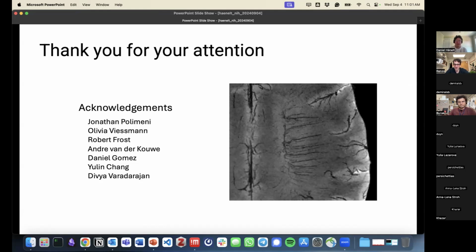Gotcha. And you're not worried about T1 steady state history effects, that you have a steady state with the Ernst angle, and then you have a break, and the navigators break that steady state, and then you go back into it? Or is the 3 seconds your volume? Yeah, there will be some changes. We did some tests, but it's also preliminary. We acquired some data to examine the changes in contrast with and without navigators, and we didn't find any big changes.